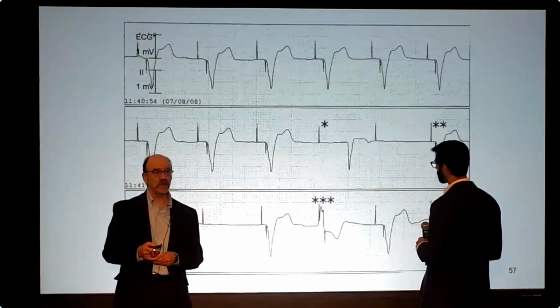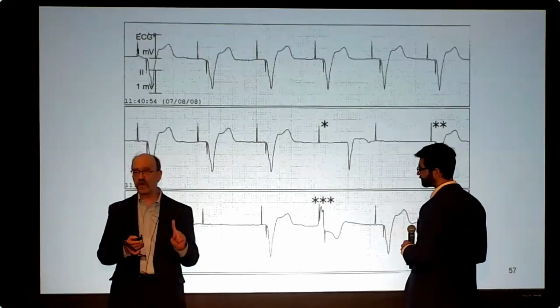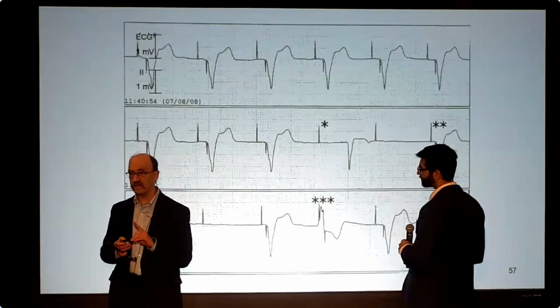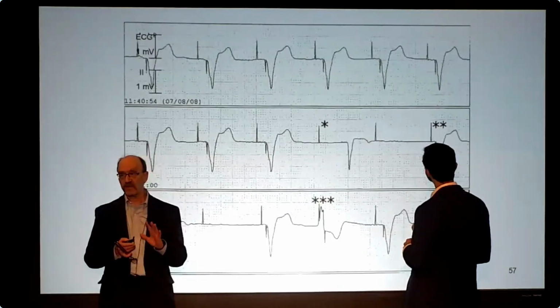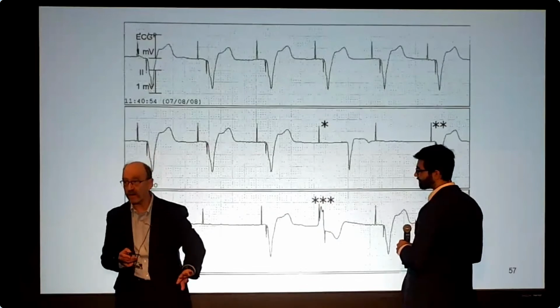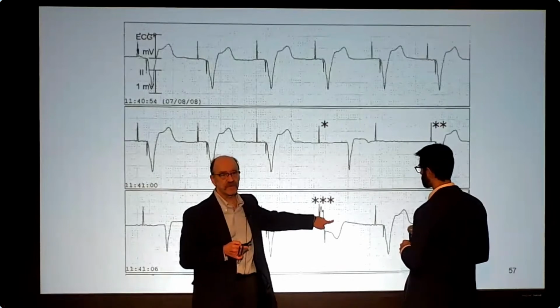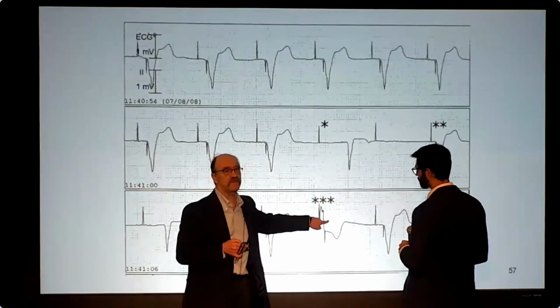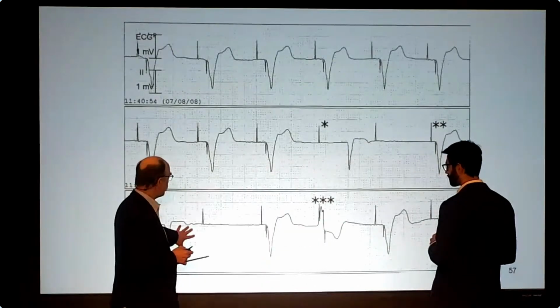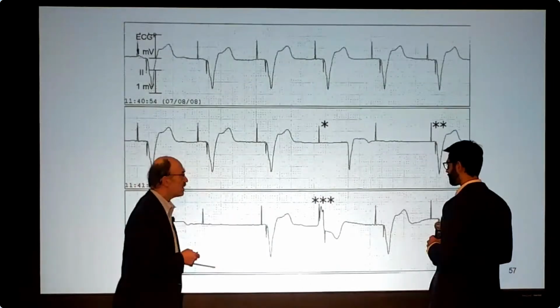Why do you V-pace with a short AV interval and not the programmed AV interval? Because you don't want the ventricular pacing spike to land in the T wave, to avoid proarrhythmia, which, although it may be rare, is possible. So this is safety pacing. Safety pacing is different numbers for different companies, different devices, different times. Pretty consistently for Medtronic, it's been 110 milliseconds. And then in devices, if you fail in 2 out of 4 consecutive beats, then you switch modes.